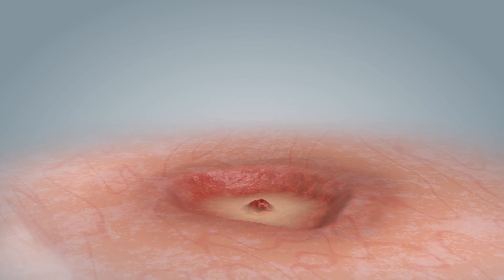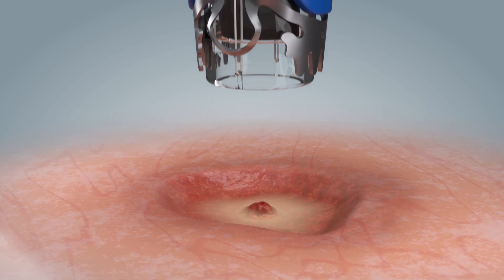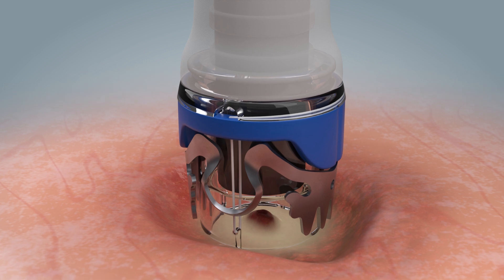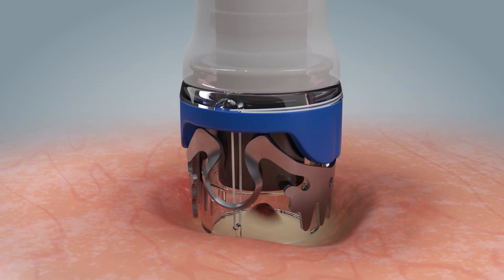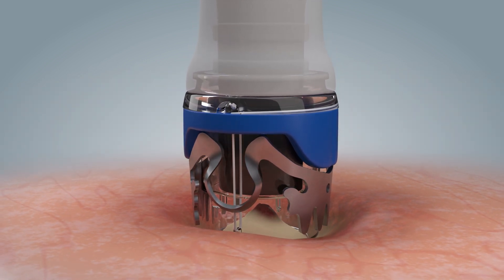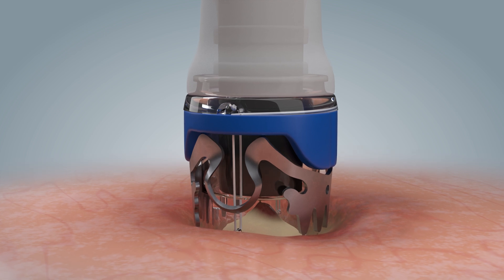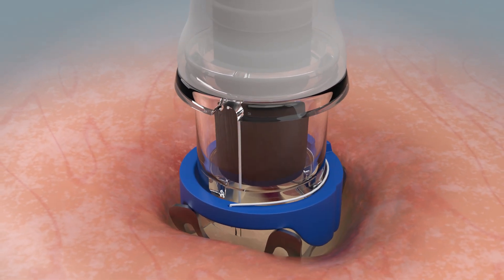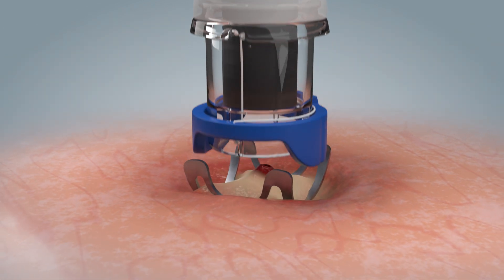In most gastrointestinal bleeding situations, the tissue can be mobilized and safely retracted into the application cap simply by endoscopic suction. Once the target tissue is in the cap, the clip can be released over the mobilized tissue and applied to the bleeding site.